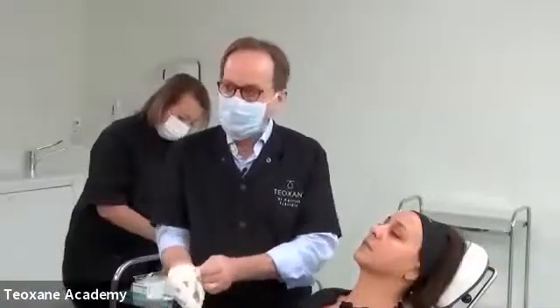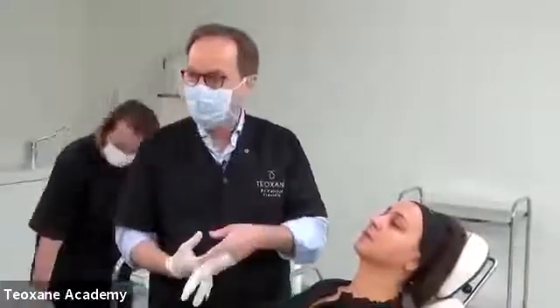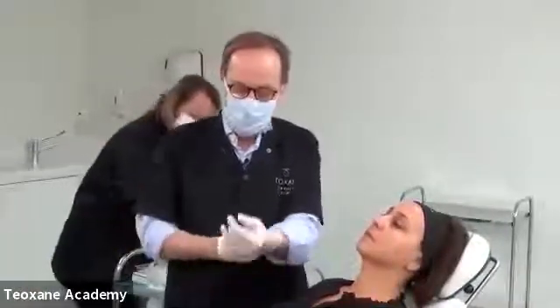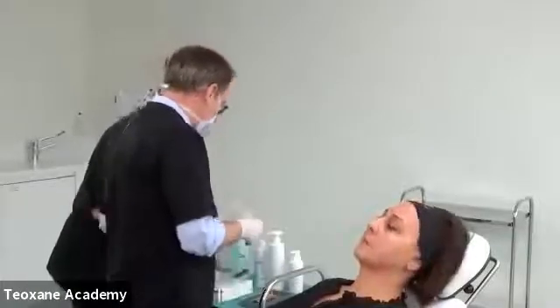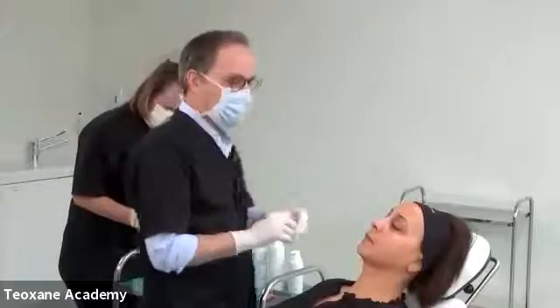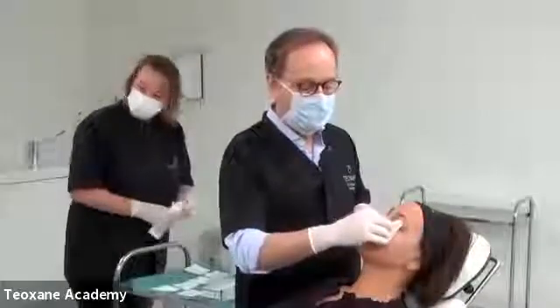So I will put on my gloves, and I will show you how I do it. But I will give you some tips and tricks. First, when you begin to do such an injection, I do it in a sitting position. Why do I do it in a sitting position? I will do the disinfection. Close your eyes. Thank you.